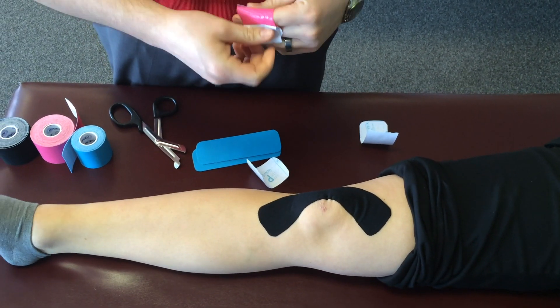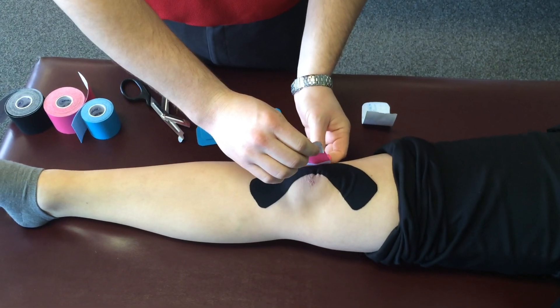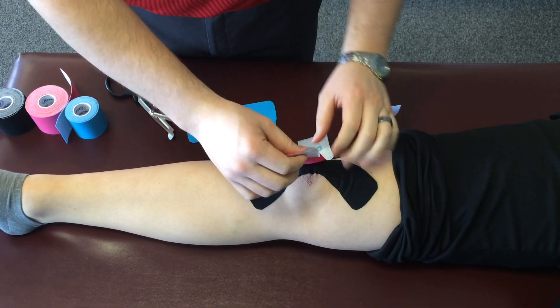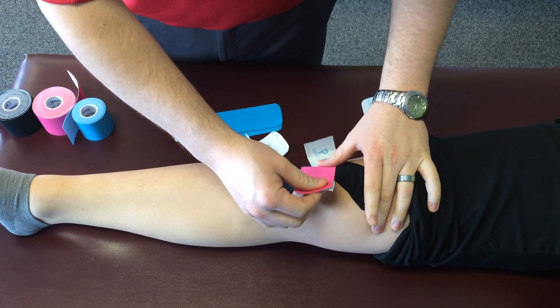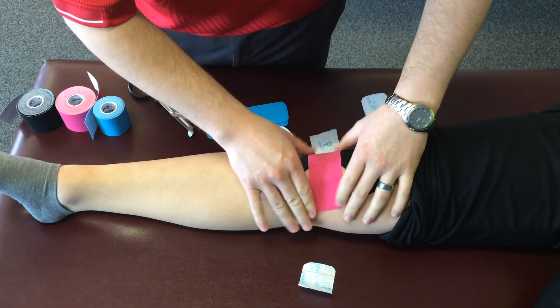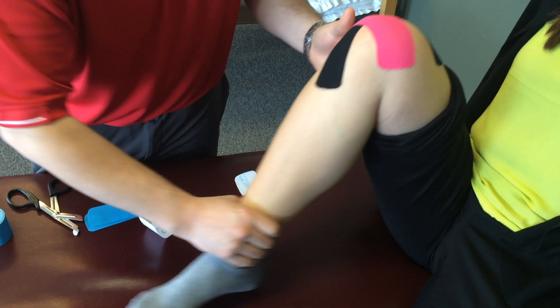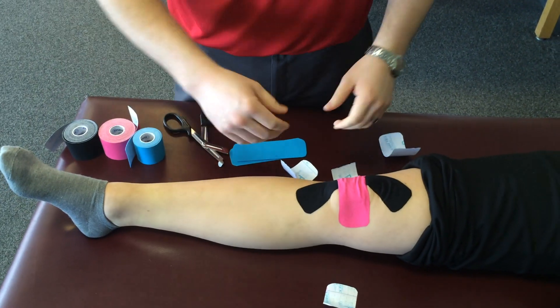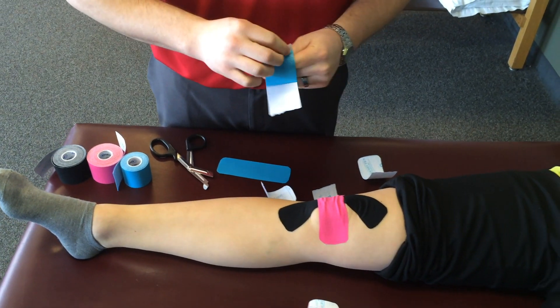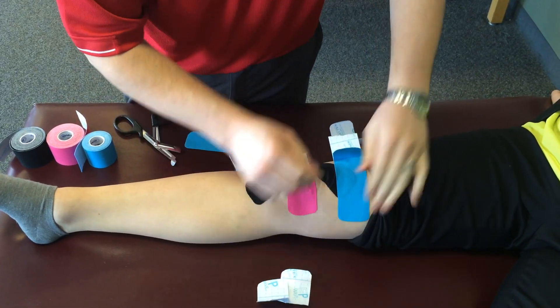The second strip I'll apply here is going to go right across the top of the kneecap. I'm going to apply on the lateral aspect of the kneecap here, attached down to the skin. And then while I push her kneecap medially — or towards the inside — I apply a little pressure to that tape. I'll check the range of motion to ensure that it feels fine. These blue strips are simply anchor strips; I'm going to put those at the top of the curved portion and at the bottom of the curved portion as well.